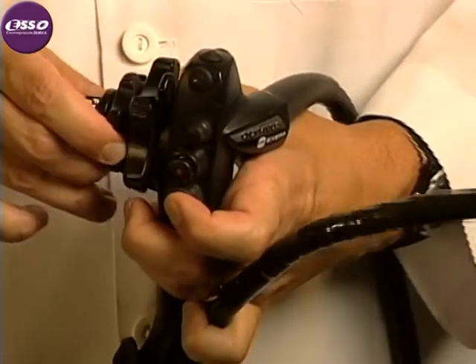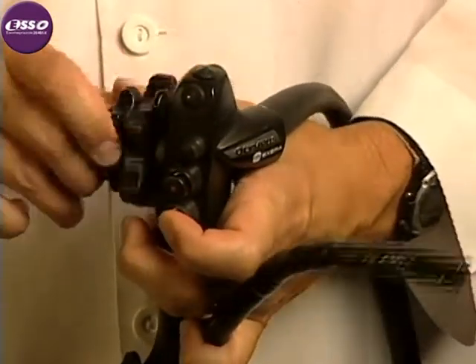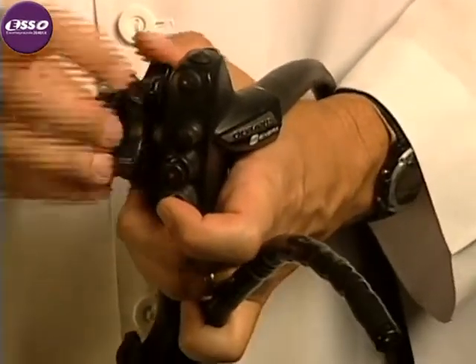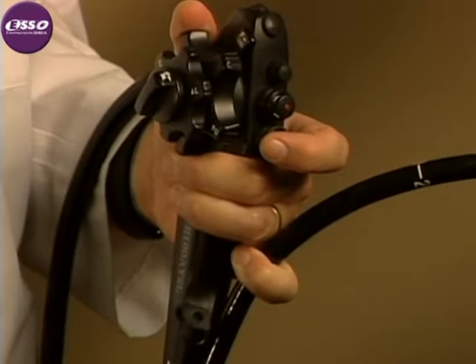True precision control of tip movement is best achieved by simultaneously controlling the up-down knob with the thumb and fingers of the left hand and the right-left knob using the right hand. In order to employ this two-handed control of the tip direction, we will need to learn what I refer to as the left-handed scope grip.